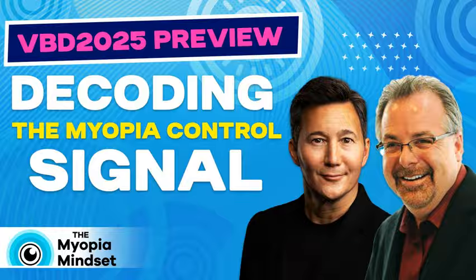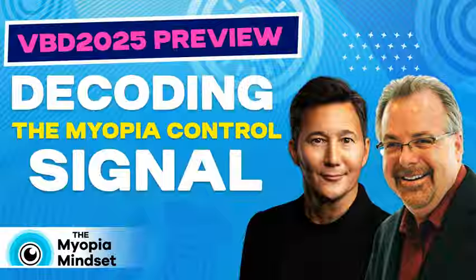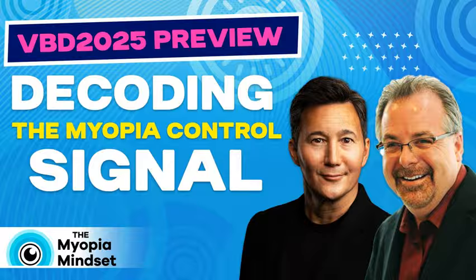We've got pretty strong data from our lab here to indicate that that is indeed the case. The stronger we make that signal, the better the myopia control is with orthokeratology.